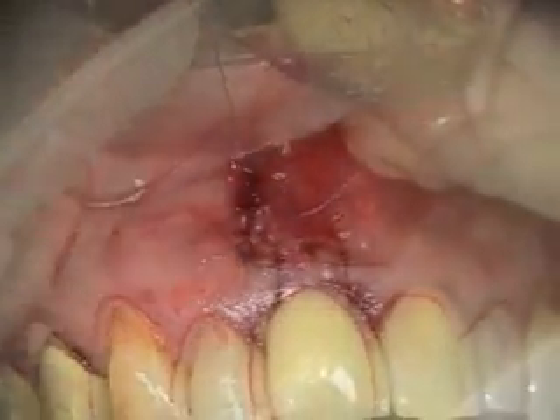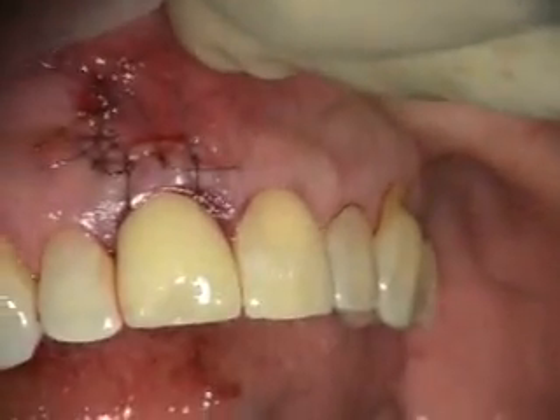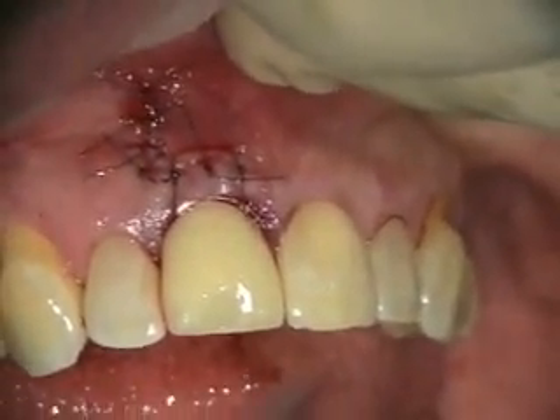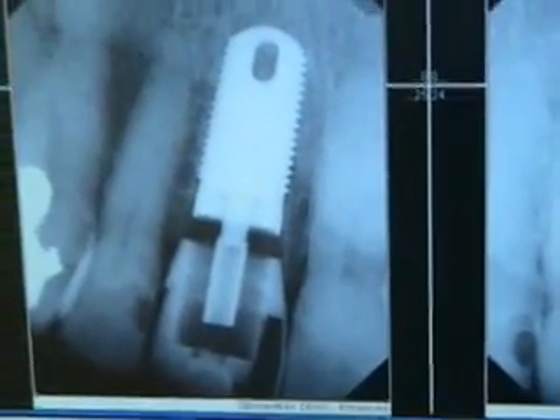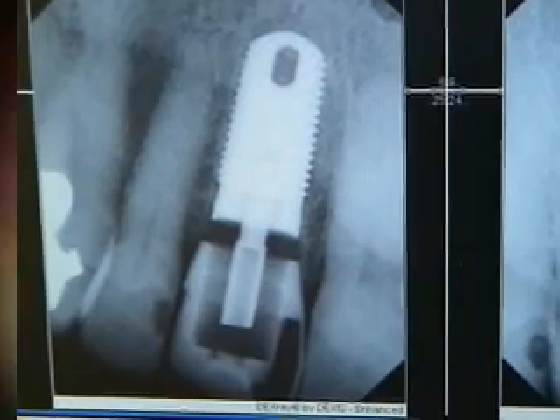We've got our dehiscence patched, got our tooth done, and we'll check it out in a couple of weeks. There's our initial x-ray and here's our x-ray today, and we're going to check her out in a couple of months.